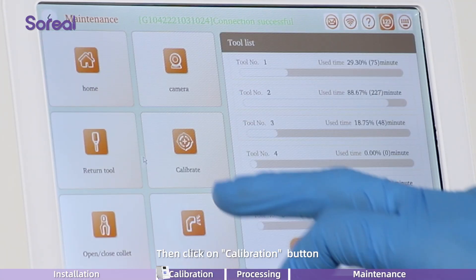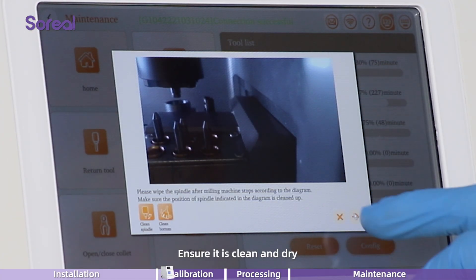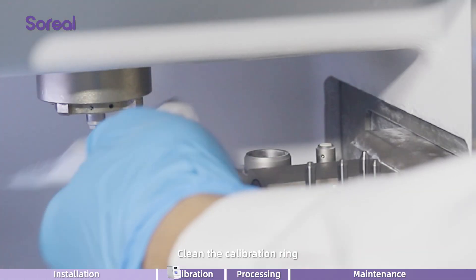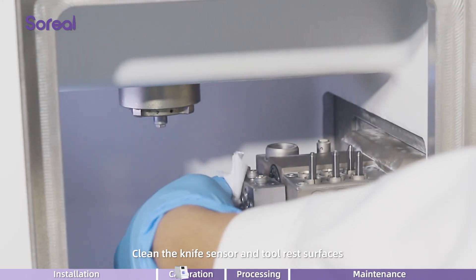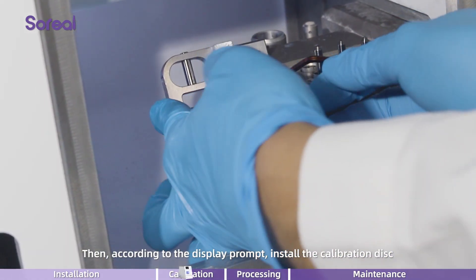Click on the maintenance button, then click on the calibration button. Follow the prompts to clean. Ensure it is clean and dry. Remove the calibration cap after the equipment stops. Clean the calibration ring. Wipe the spindle and ensure the spindle is clean. Clean the knife sensor and tool rest surfaces. Then, according to the display prompt, install the calibration disc.